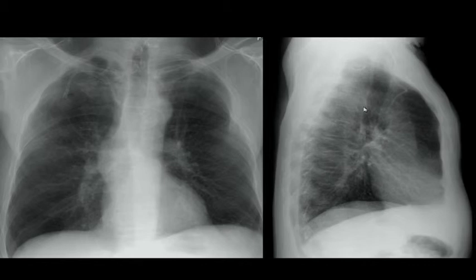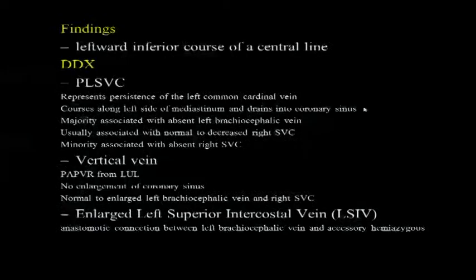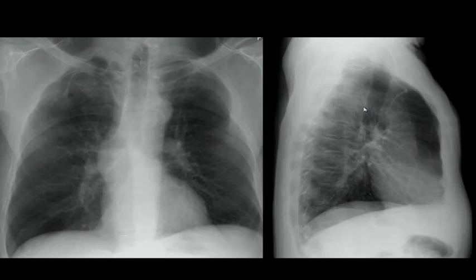Actually, when I was doing medical school, I had a chest X-ray where the central line would come from here and then turn this way. It was just a single frontal chest. So if it is turning that way, ask them to get a lateral and it would just go backward. It was in the azygos. Yeah, it will go back.